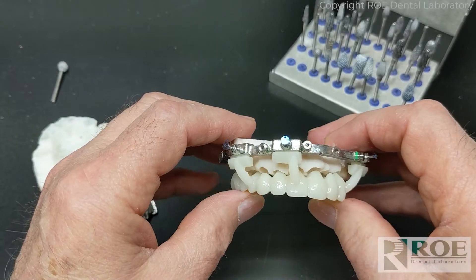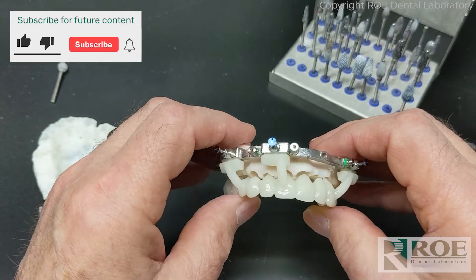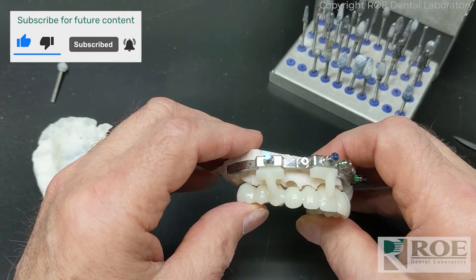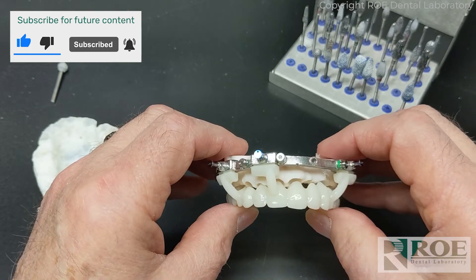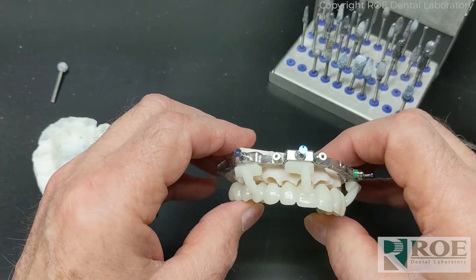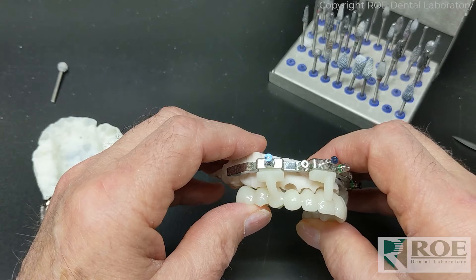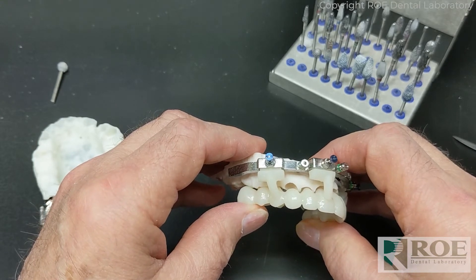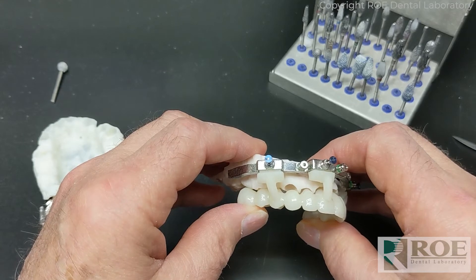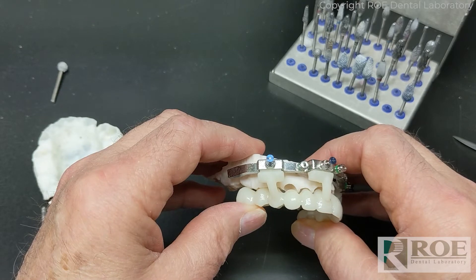The first thing we try to do when we get these cases ready to fit to the socketed model is see if we can get the prosthesis to fit without removing a lot of bone. We want to try to relieve some of the area on the prosthetic or the pontic areas without ruining the bridge itself, so that you don't have to remove more bone than you need to. As little as we have to do to preserve bone is good.